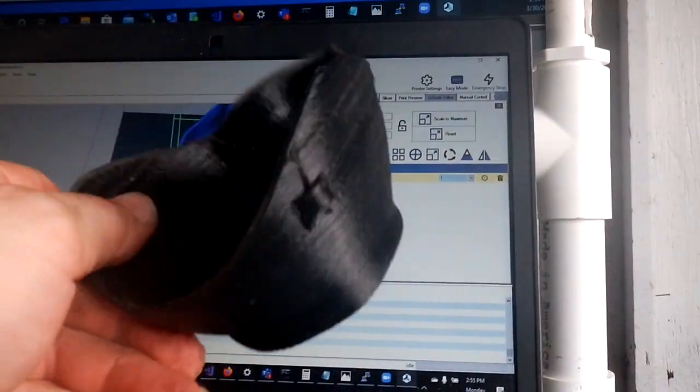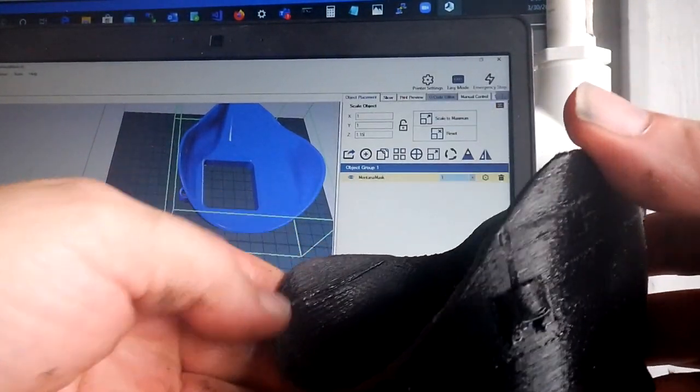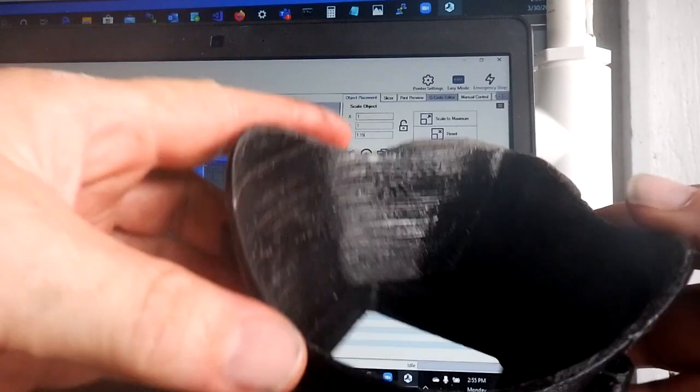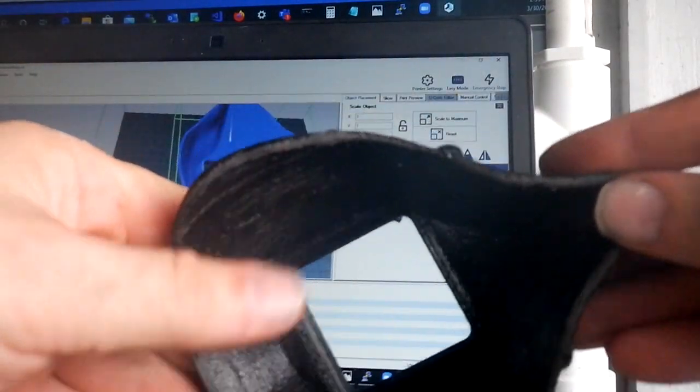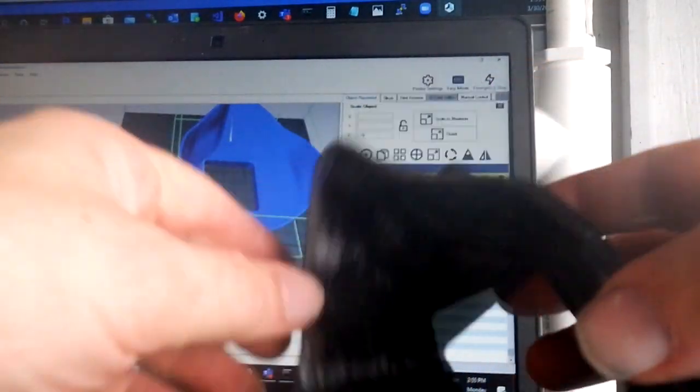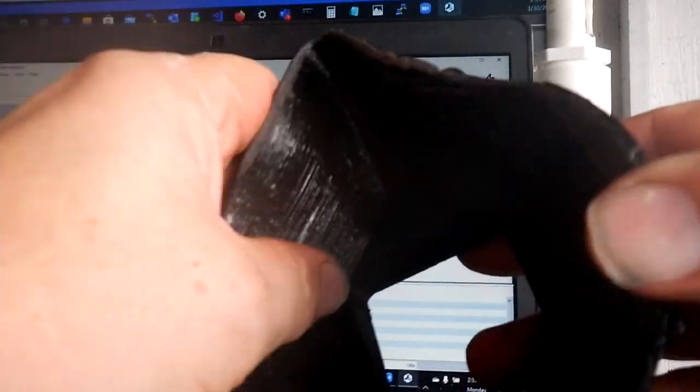So this is the mask here after a little bit of sanding around the edges to make it comfortable. This is the mask itself.